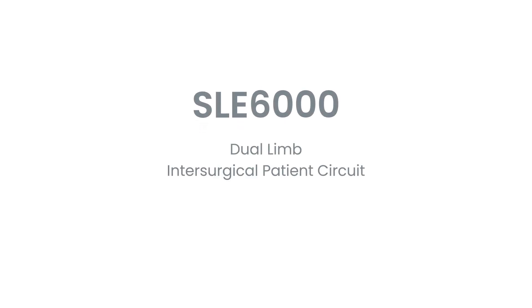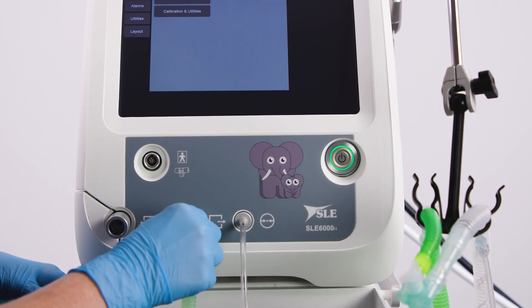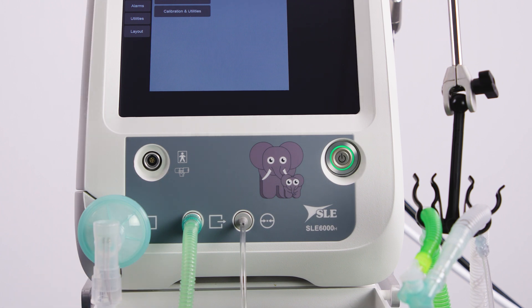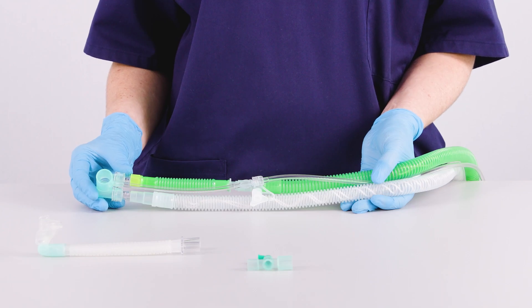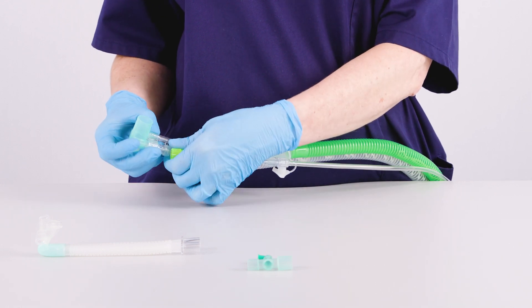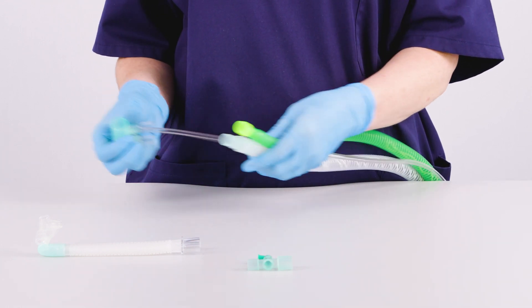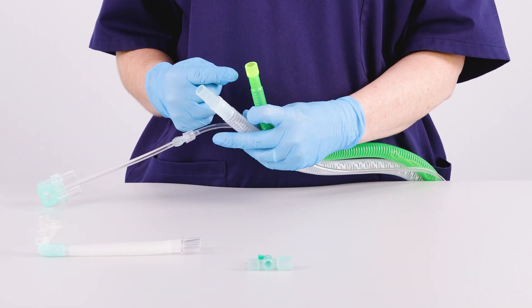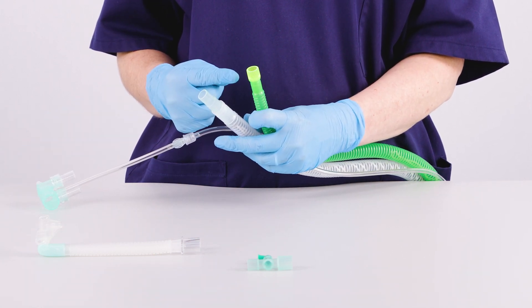Dual-limb SLE6000 inter-surgical circuit: Connect an inter-surgical SLE6000 patient circuit to the ventilator. To connect the SLE mini-flow to the patient circuit, detach the inspiratory and expiratory tubes from the Y-piece. Make sure that the yellow restrictor is still connected to the end of the inspiratory limb.